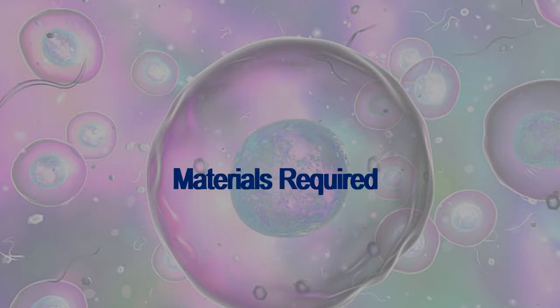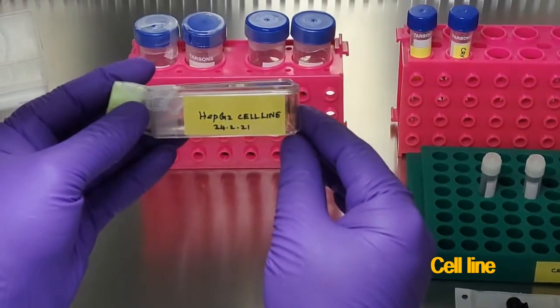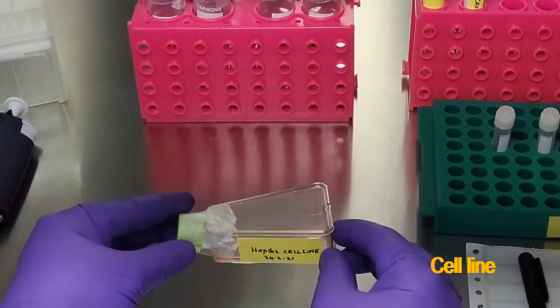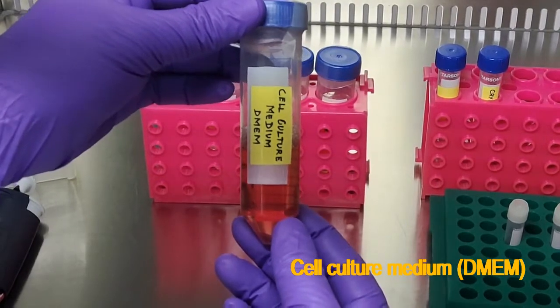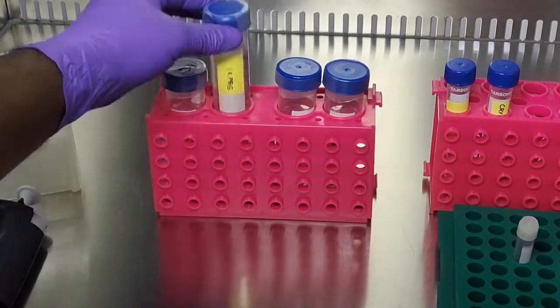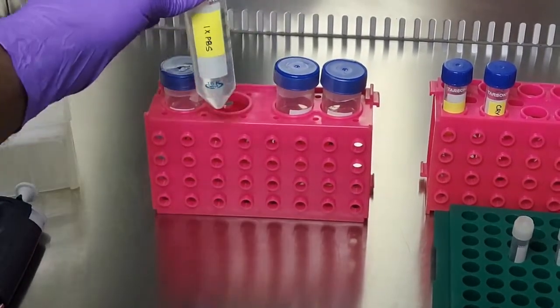The materials required for this experiment include the HepG2 cell line — that is the cell line we are going to cryopreserve, which is in the tissue culture flask. We also need DMEM medium, phosphate buffered saline, and trypsin.